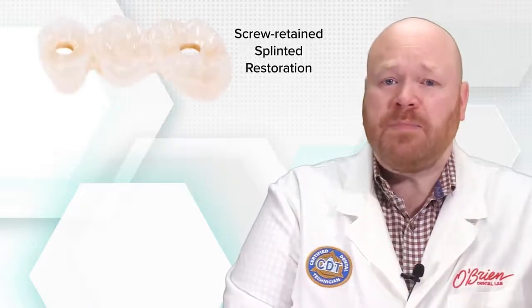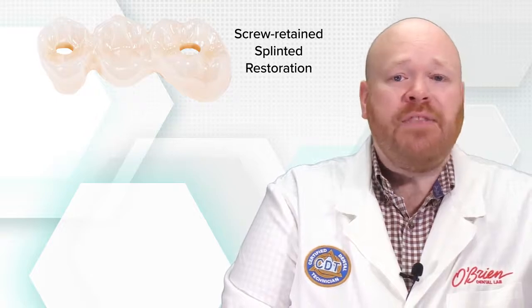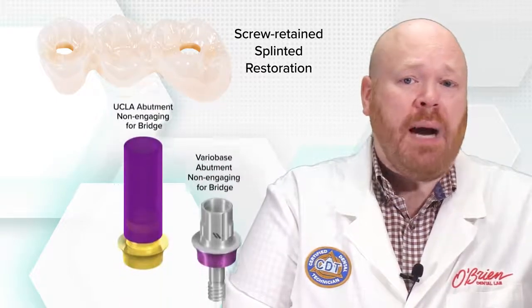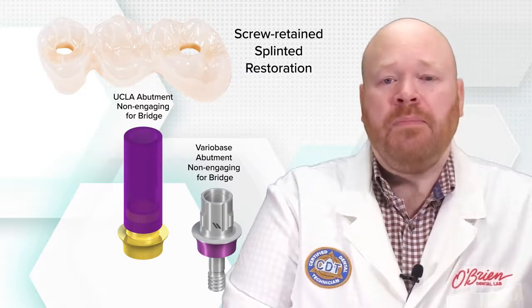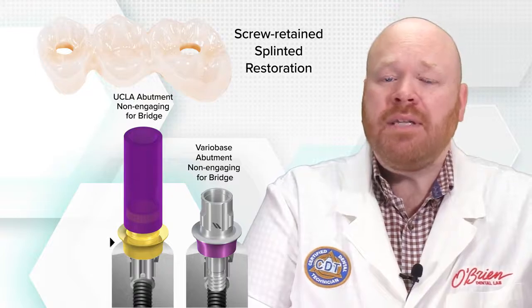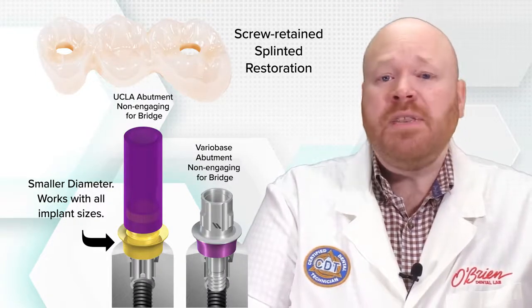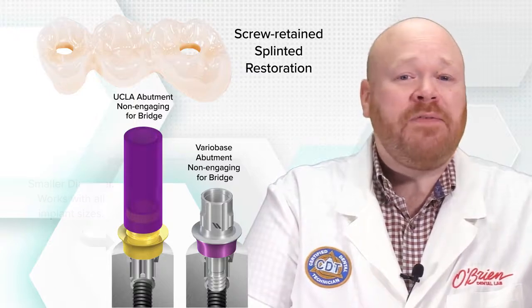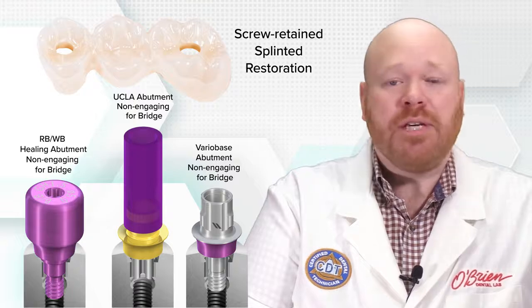And there's one more thing. If you want screw-retained splinted restorations, the lab will need to use non-engaging abutments. And there's actually just one non-engaging option, and it has an interface that's different than the other two that I just talked about. It's similar to the WB components in that it covers the top of the implant, but it's got a smaller diameter that works with all of the implant sizes. Due to this difference, Straumann offers specific bridge healing abutments that should be used when planning for splinted screw-retained restorations.